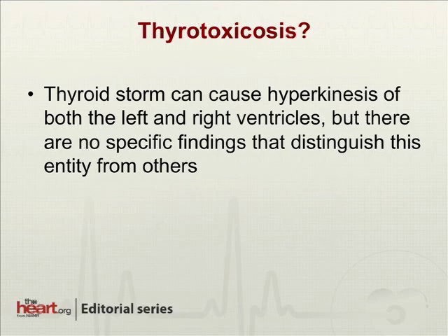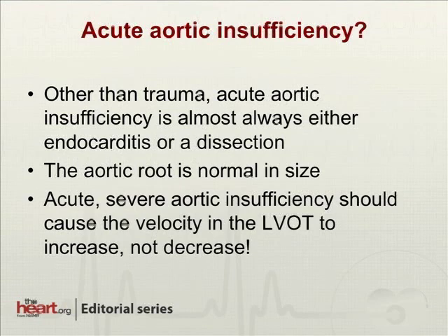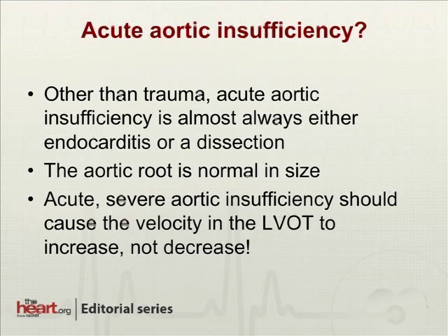Could this be thyroid toxicosis? A thyroid storm can cause hyperkinesis of both sides of the heart, but there are no specific findings to distinguish that from any other entity that causes a hypercatecholamine state. Could this be acute aortic insufficiency? Other than trauma, the only things that really cause acute aortic insufficiency are infection or dissection. There are no lesions on the aortic valve and the aortic root is normal in size — dissections don't occur spontaneously in normal-sized aortas. More importantly, aortic insufficiency should cause an increase in the velocity of the LVOT, but the pulse wave Doppler of the LVOT demonstrates a low velocity. Therefore, aortic insufficiency is highly unlikely.